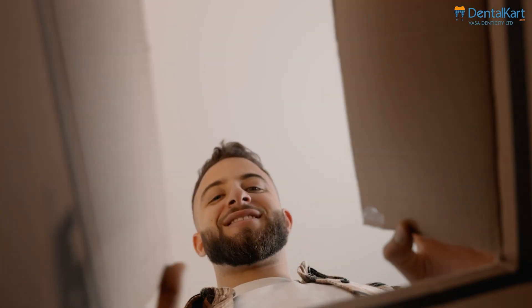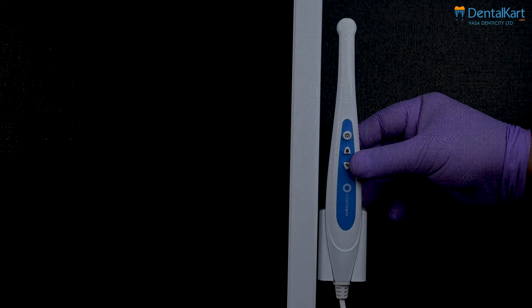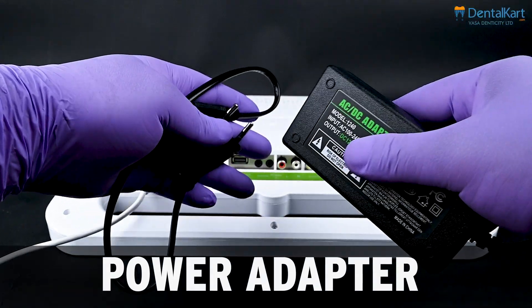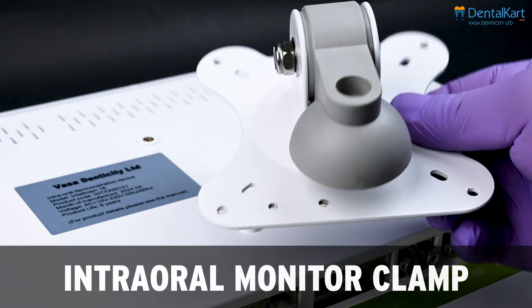Let's see what we get inside: camera screen, camera handpiece, remote control, power adapter, camera sleeves, and intraoral monitor clamp.